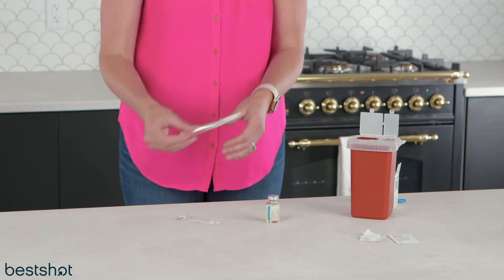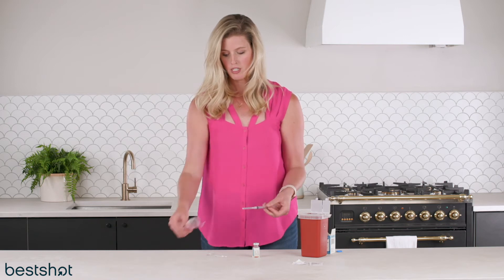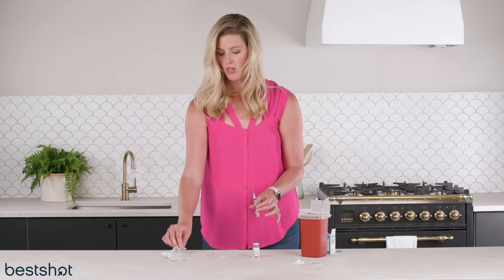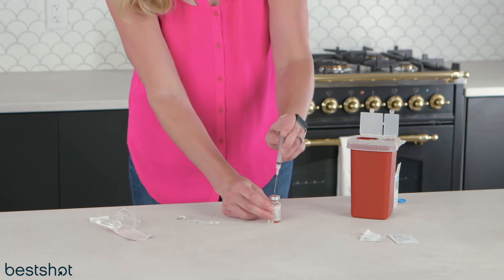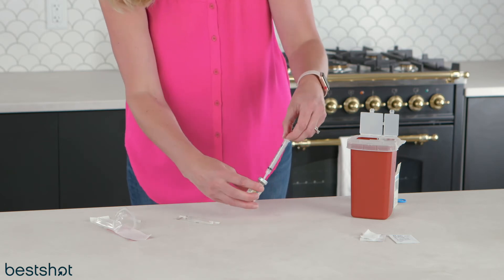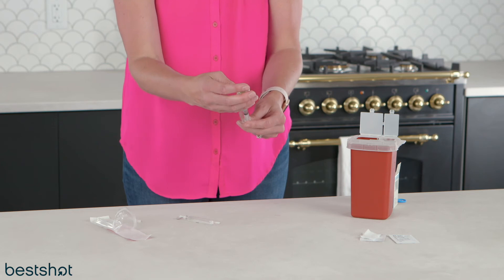And then you are gonna use this big old honker — it's a syringe that's attached to a mixing needle that is 18 gauge, which is large. Luckily this is not the one you'll be injecting yourself with. You're just gonna go ahead and pop that in and then draw back to whatever your dosing is. In this case I'm just gonna draw back to half an ml.